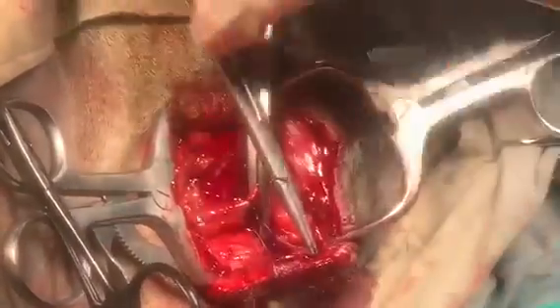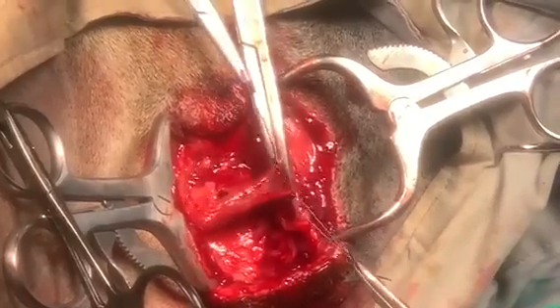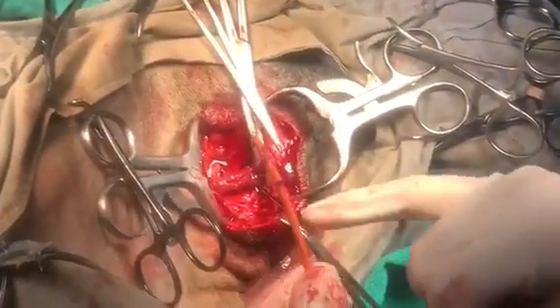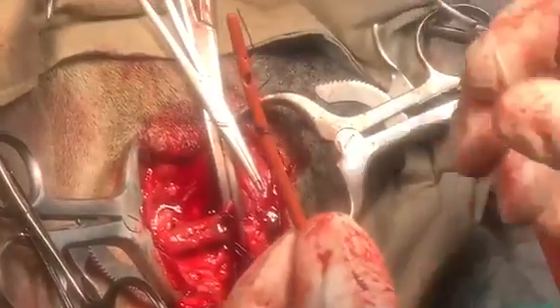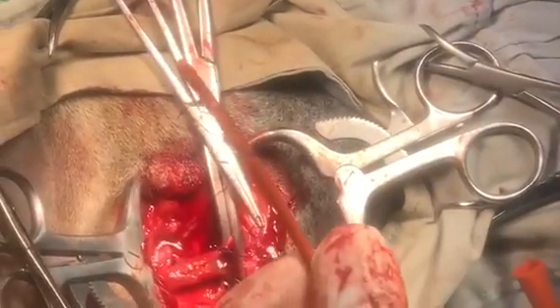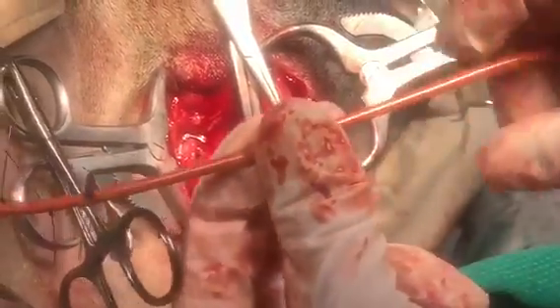We have opened up and dissected the jugular out. We have it ligated proximally with a large hemostat, and two stay sutures placed in the jugular itself. We will be making an incision in the jugular and passing our red rubber catheter — this is the catheter with a snare device. It essentially has three pieces of suture material; this is a 10 French with aught monosorb suture material, and you can see it has a little bit of a bottle brush effect. The plan is to go down the jugular, twist, and in doing so ensnare the heartworms, which we can then pull out.